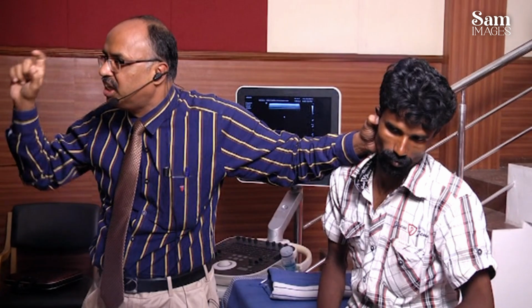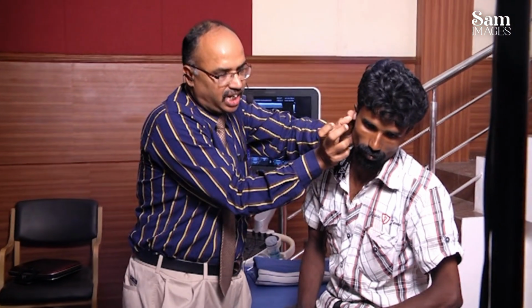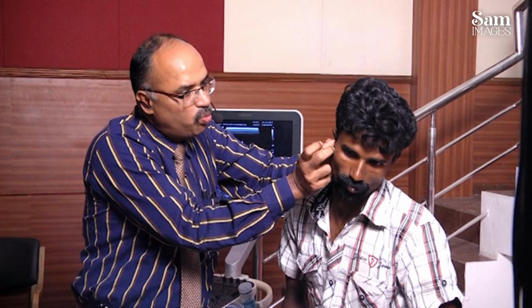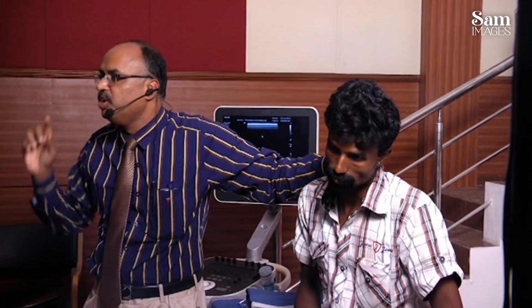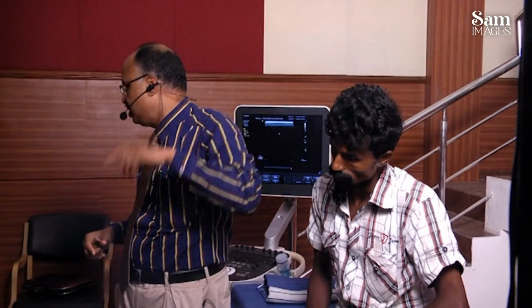Then I will apply a lot of gel. That is the most important thing. You have to apply a lot of gel there and keep the transducer like this, longitudinally, with more of your transducer coming over the tragus of the ear. That is what you have to do. When you keep it there, you can see the joint space, which I showed in the morning class.